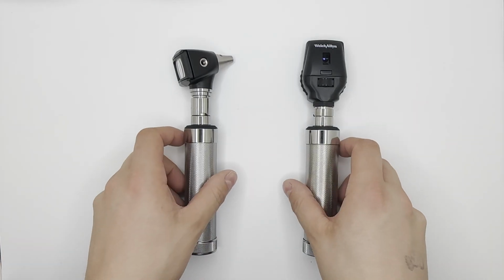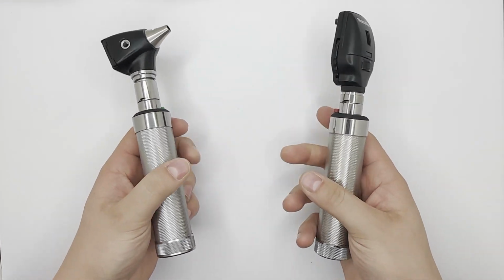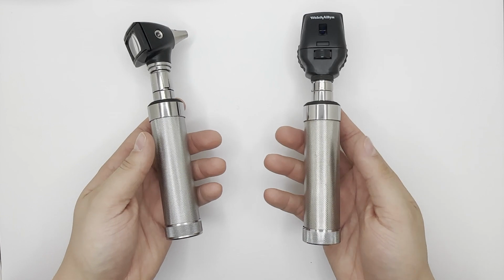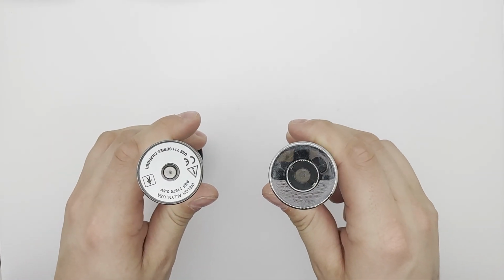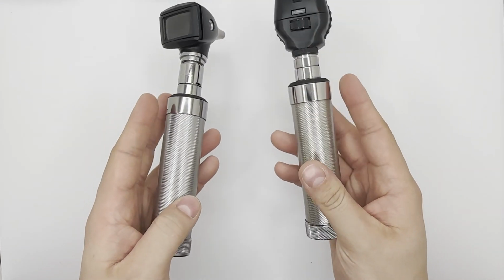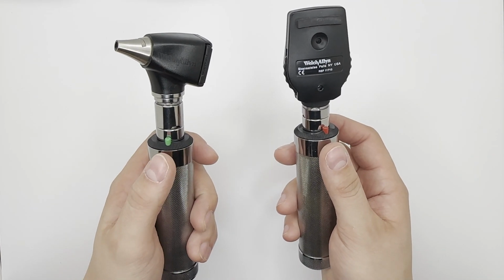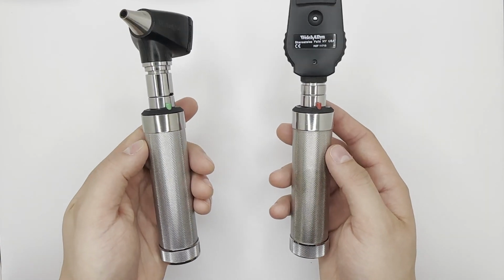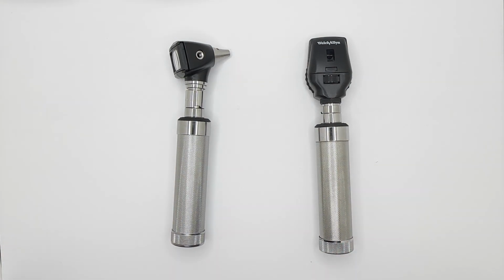There are many similarities between both the design and function of otoscopes and ophthalmoscopes. For example, some handles are universal and can interface with both otoscopes and ophthalmoscopes. For these reasons, many of the discussed designs, functions, and troubleshooting techniques apply to both devices. When information applies to both otoscopes and ophthalmoscopes, the word scope will be used.